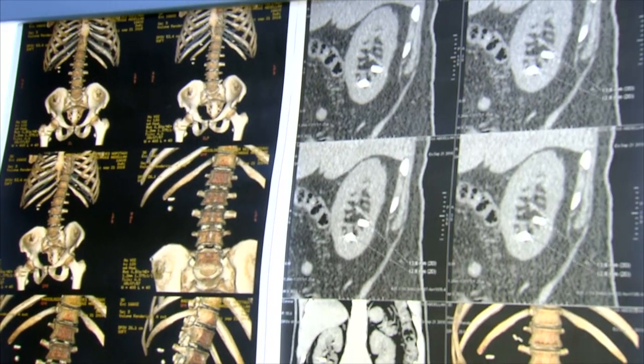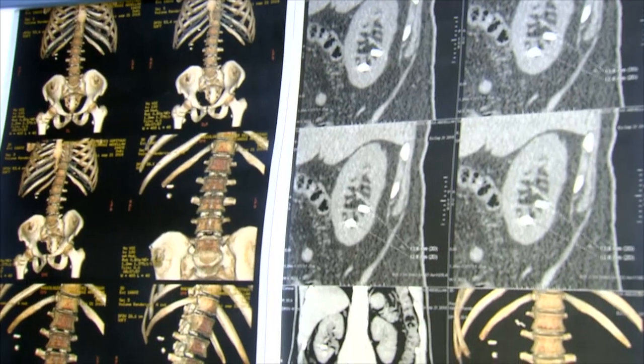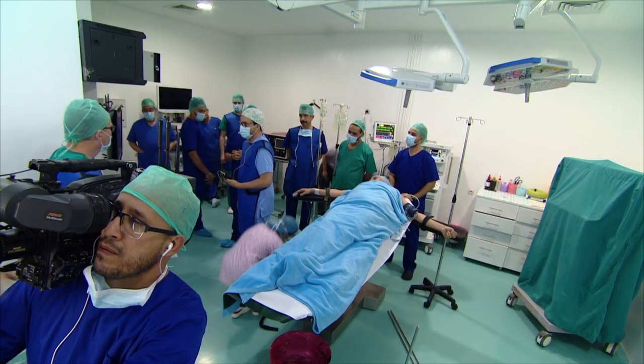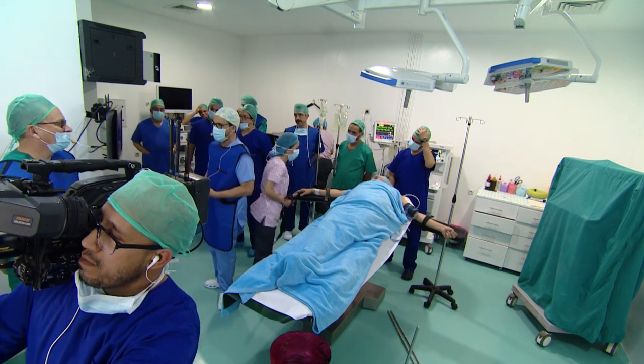Okay, so we'll talk a little bit in English because Professor Lahme is here. So yes. The first case will be for Professor Lahme, and we will be dealing with the lower calyceal. What do you think? Is this a middle or lower calyceal? Both of them are lower.